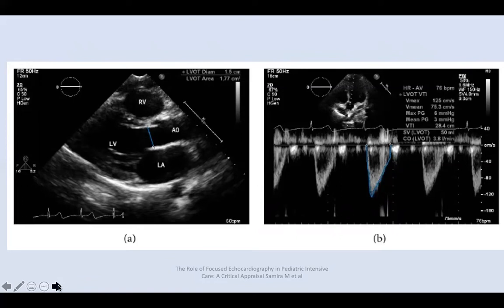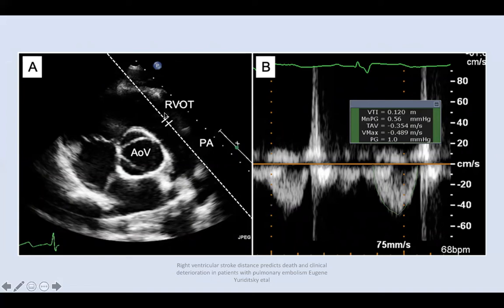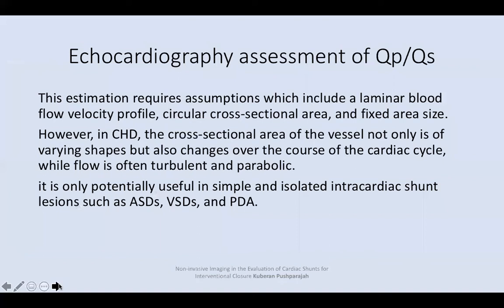In short axis view below the pulmonary valve, use PW Doppler and trace — you will get the pulmonary valve VTI, and then the machine should calculate Qp/Qs.